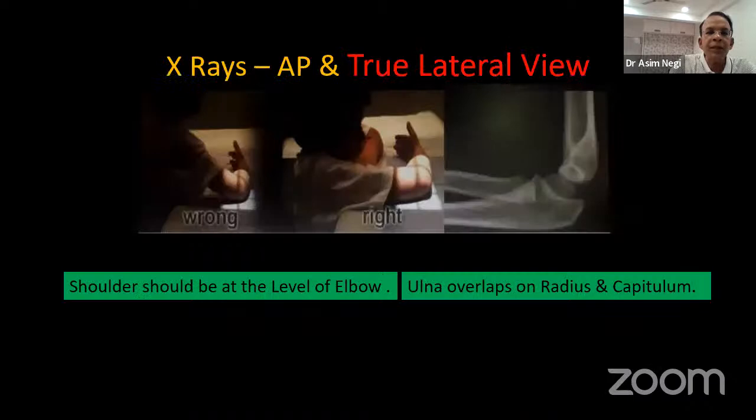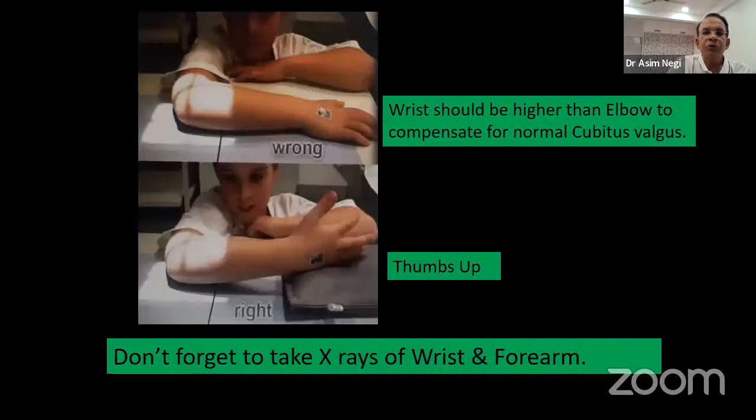For taking a proper AP and true lateral view of the elbow, the shoulder should be at the level of the elbow, as shown on your right. And the way it is done on the left is absolutely wrong. Most of the time it is done like that. On a perfect lateral view, ulna will overlap on radius and capitulum as shown in the X-ray here. Your wrist should be slightly higher than the elbow to compensate for normal cubitus valgus, and thumb should be up. And please do not forget to take the X-ray of the forearm and the wrist. There may be surprises there and you may miss a fracture.